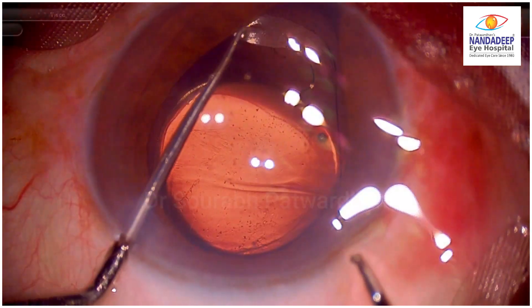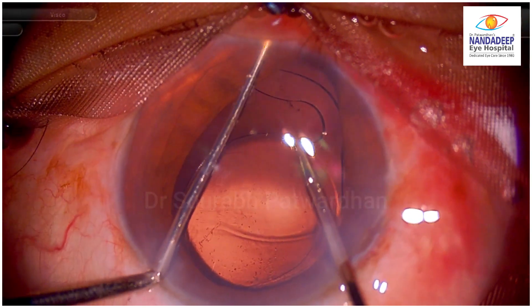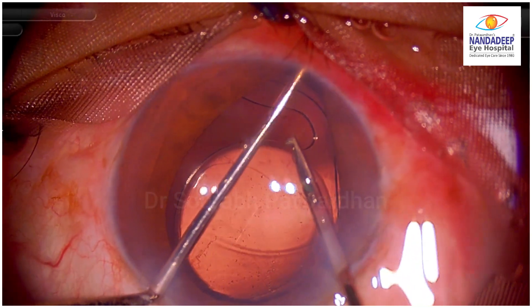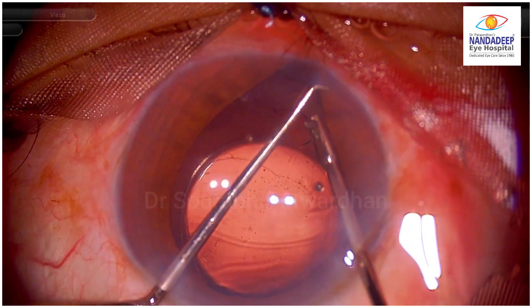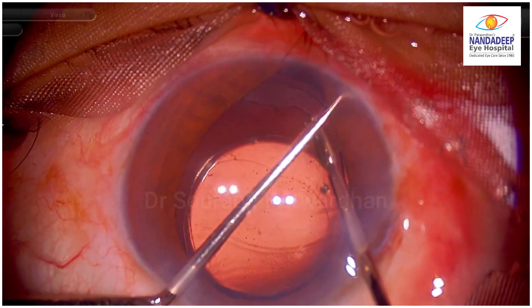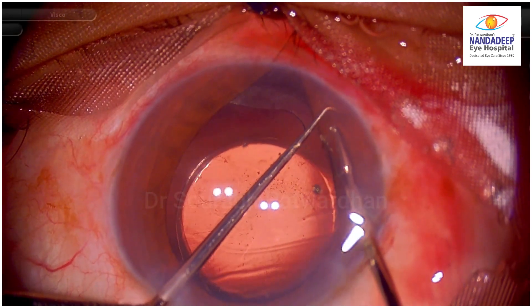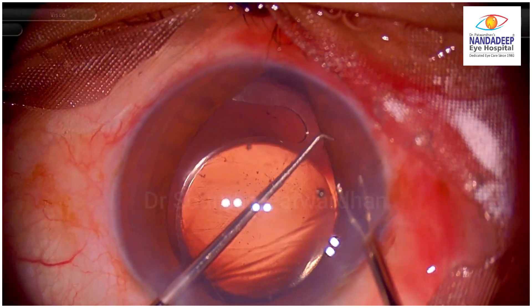So I am called in and I am reviewing the situation — same instruments, just a bit more experience handling situations like this. When you are pulling the CTR which has gone into the angle, you have to be very careful not to damage the root of the iris there. So initially I am trying to pull it so that I can hold the CTR with the micro grasper.